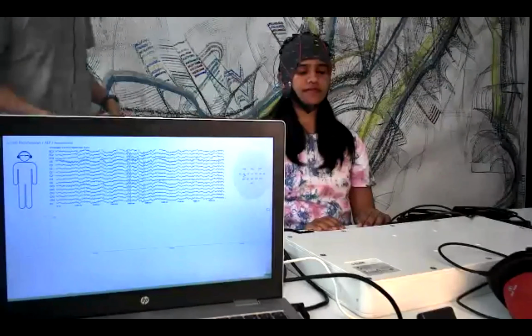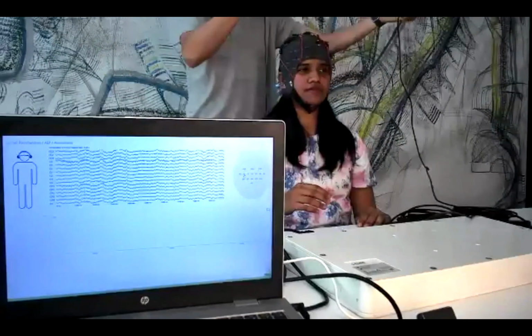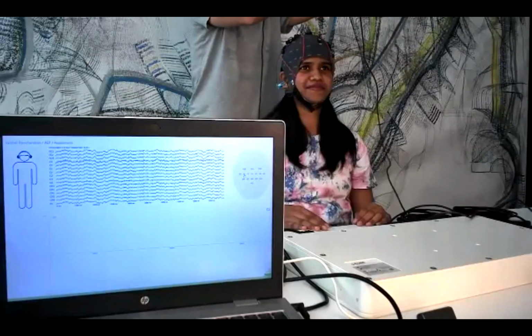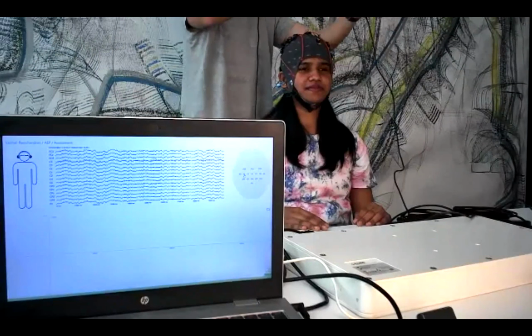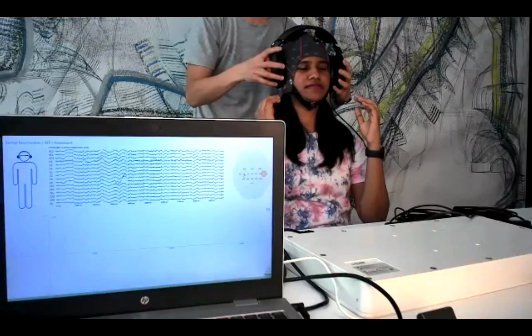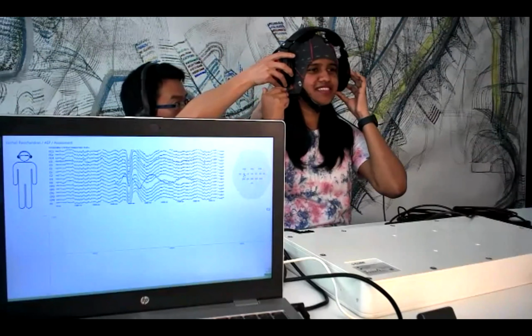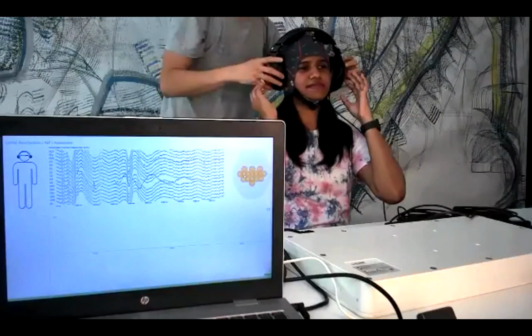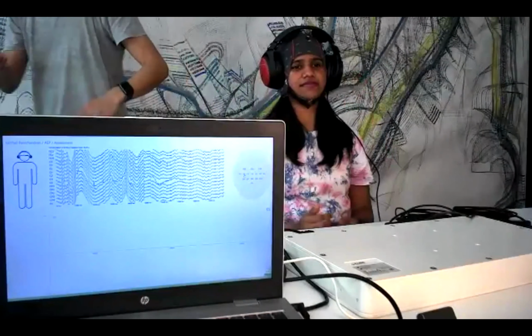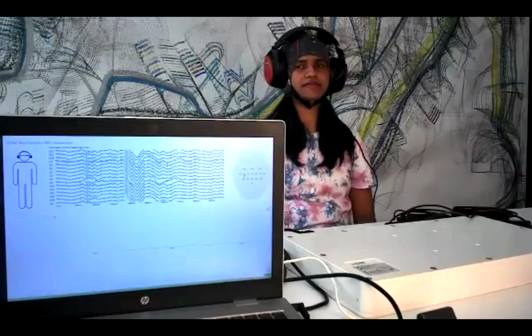Then I'm going to put on the headphones. It's a little bit heavy. Actually, it works better if I'm doing this with the patient lying on the bed. Yeah, we can put it on. Is it okay? Yeah, it's okay, let's start. Okay, it's better? Okay. So let's see how the signal looks right now, because there might be some interference from the headphones.